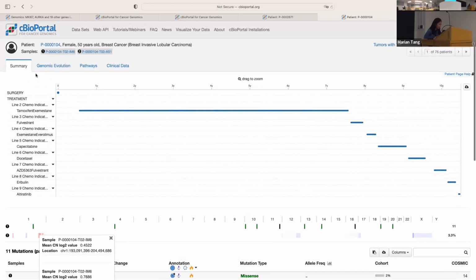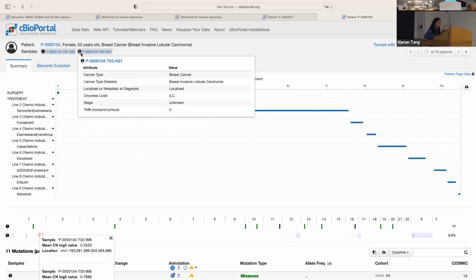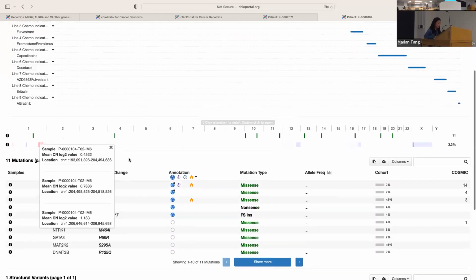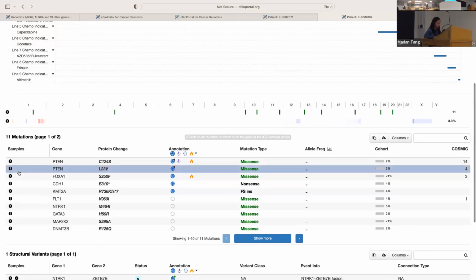Sorry, to reference back here, you can see that sample 1 has a black dot and a 1 and 2. So that means any of these entries here will be pertaining to that specific sample.